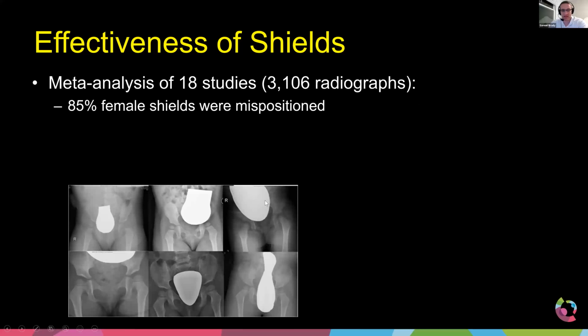Now, was it just that this was maybe not done properly? Yeah, maybe some of this was a little sloppily placed. But the other comment I would make is if you look at these, the different shields, they're all different sizes, they're all different shapes. And so you have the potential to cover up surrounding anatomy quite extensively.